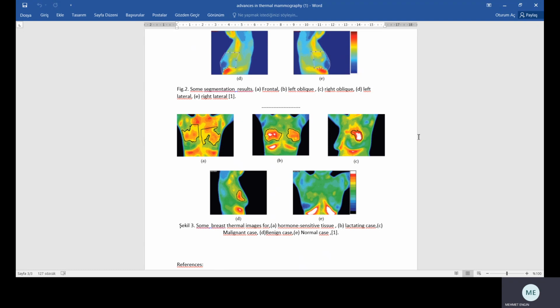A simple such classifier is a random forest, which is able to identify the significant discriminatory features and learn combinations of the features and feature groups that help decide on malignancy subjects. Other classifiers include support vector machines, k-means classifier, and deep learning methods.